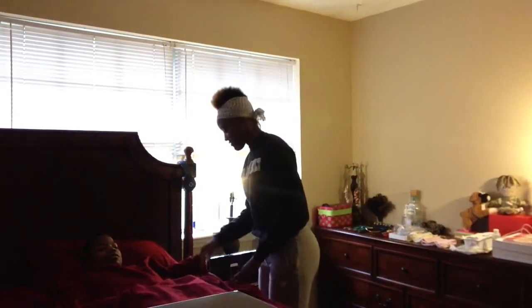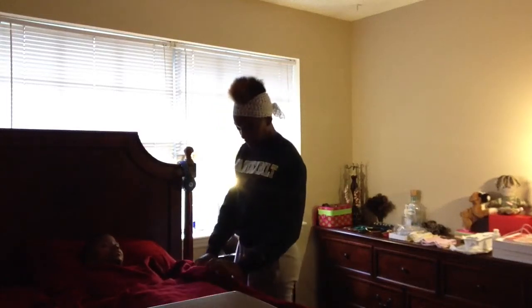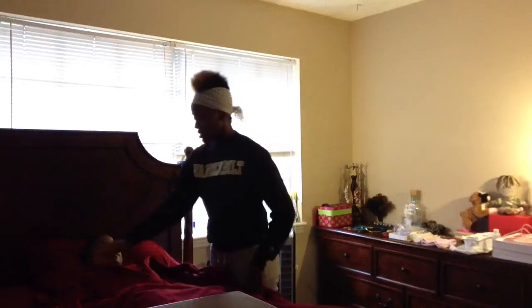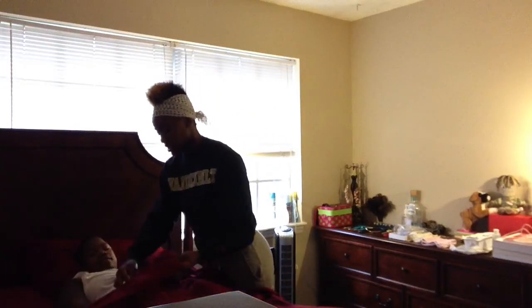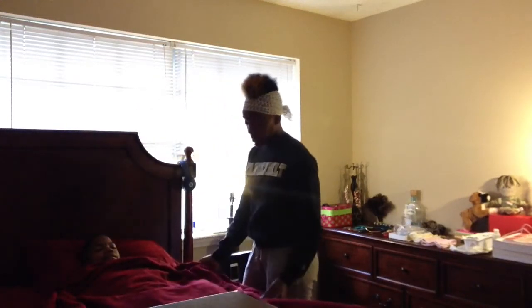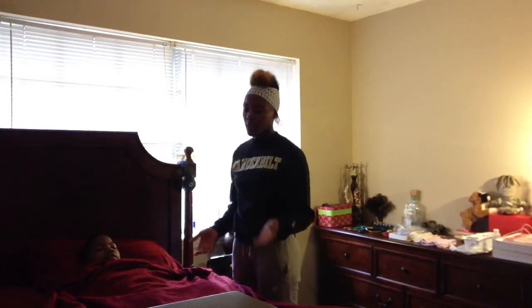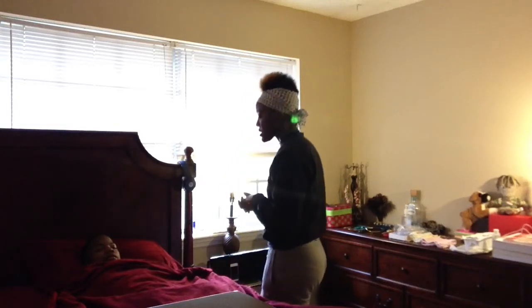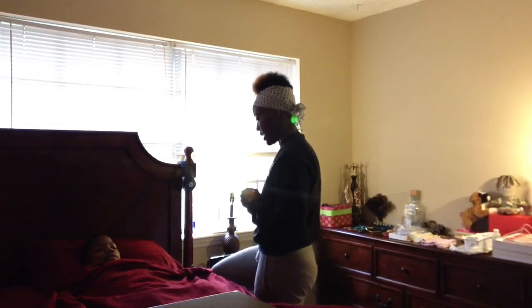I'm going to verify Sophia's name and one other identifier against the medical chart. And I'm also going to check Sophia for any allergies. Sophia seems to have no allergies. I'm going to explain the procedure to Sophia. While I'm doing that, I'm going to raise the bed to a comfortable working position so I can maintain good body mechanics. So, Sophia, we're going to be giving you an enema today.